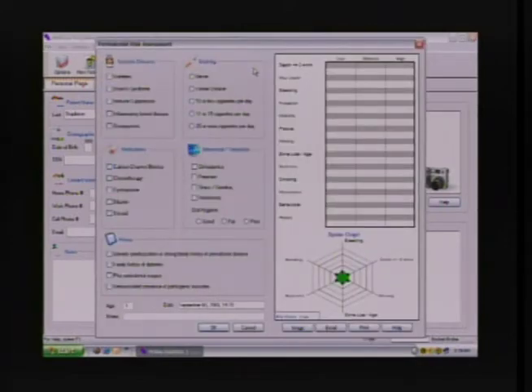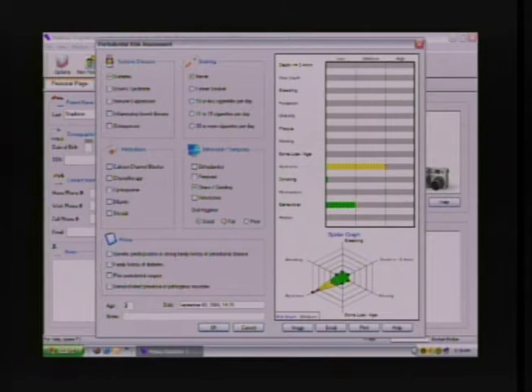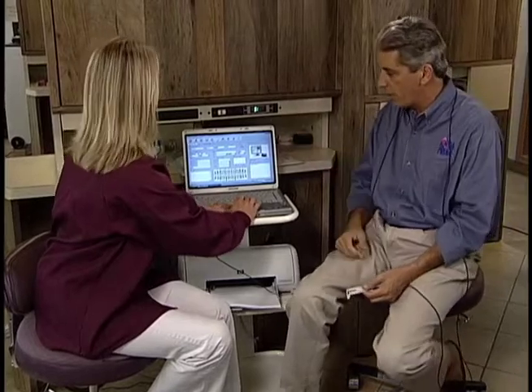And you're running through a query with the patient. The value is in the conversation. So let's just click on some items here. Diabetic, never been a smoker. Everybody's got some bruxism, some stress and grinding. Oh, yeah. I know I do. Good oral hygiene. And do you have any family history, genetic predisposition for perio or diabetes? No. And remember that it is always a function of age. Okay. That's right. You need to highlight it, and then that's it. Perfect. We'll click on OK. We'll get the rest of that information from the actual periodontal exam.